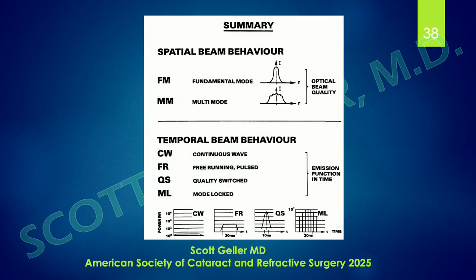Here we go again on some more laser physics. The beam quality, which is important. Fundamental mode, which is what I usually use in the vitreous. And multi-mode, which has other uses in the eye for, let's say, iridotomies or other functions.